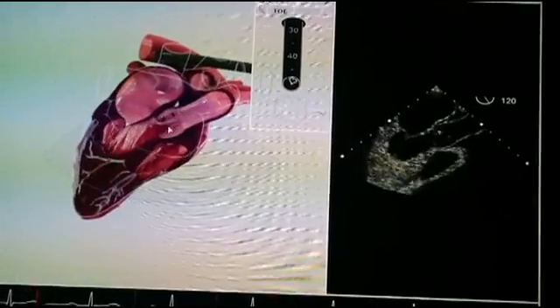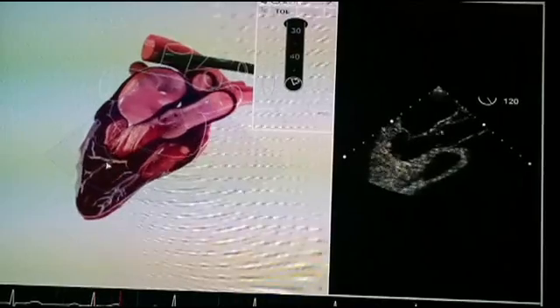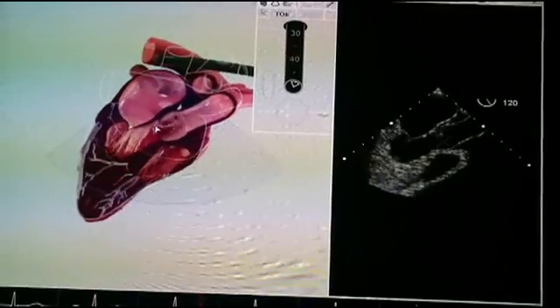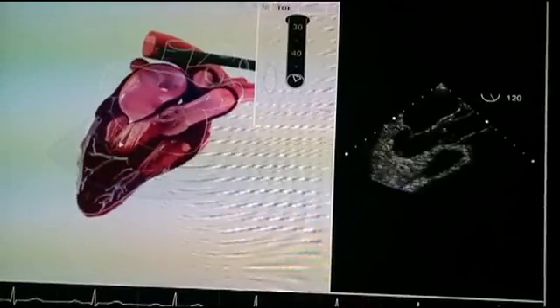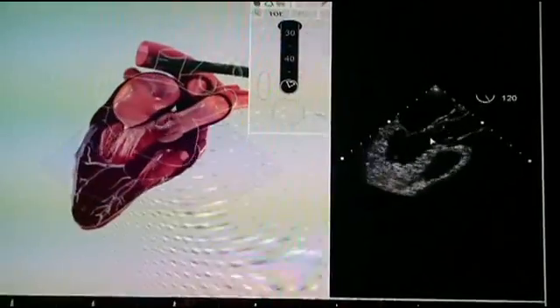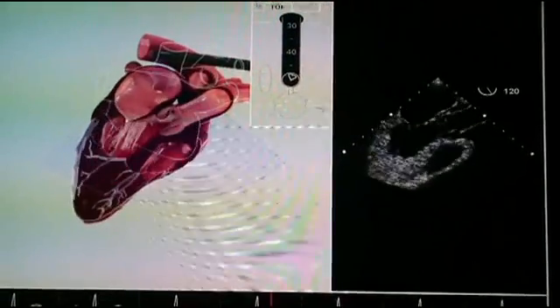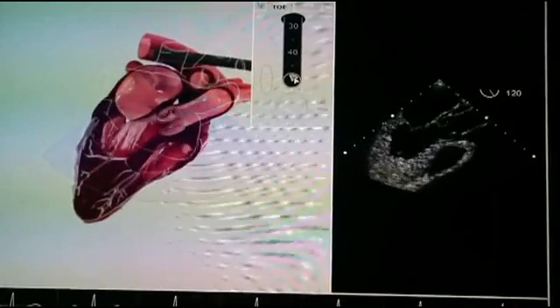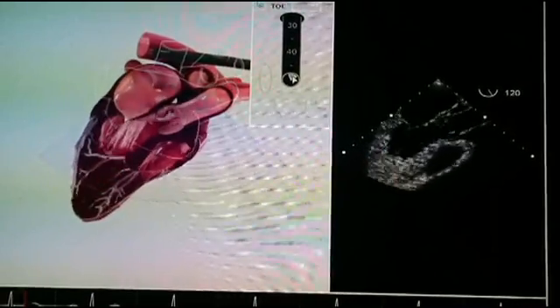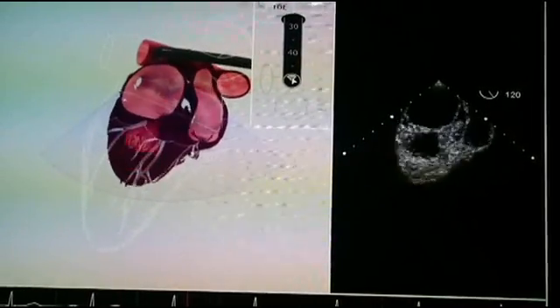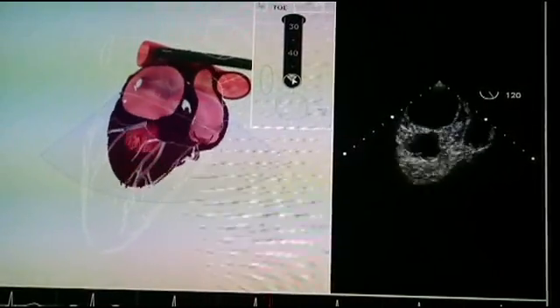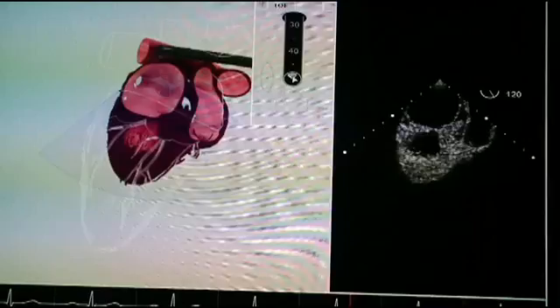Here on the left-hand side, we can see the simulator-based image. You can see the same structures here. From this view, what I need to do to get the left pulmonary veins is to just rotate to the left of the patient — extreme left of the patient — which is anti-clockwise.